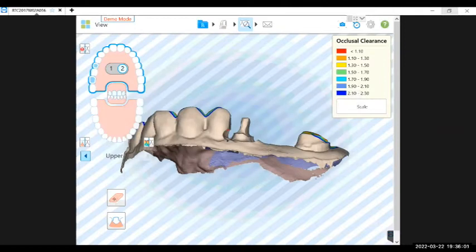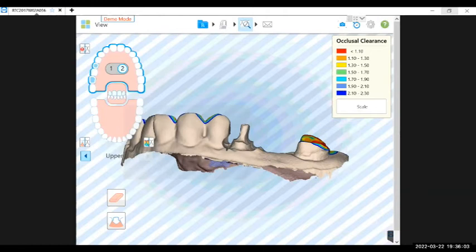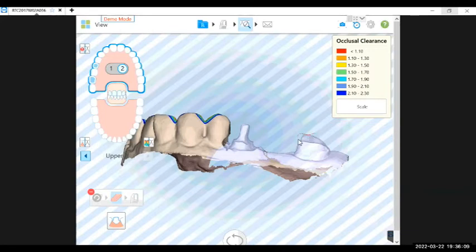That's not really lateral. Okay. Hit the eraser tool, and I'm just going to circle this one. Unfortunately, at least at this time, if you needed to perform occlusal reduction on both of the preps, you're not able to do both of them at the same time.